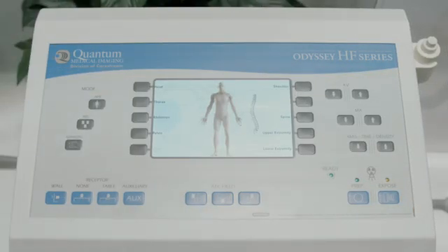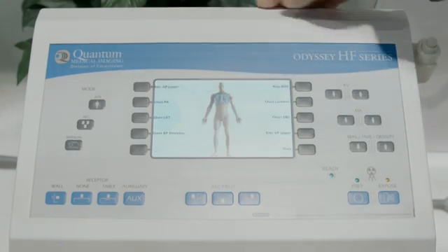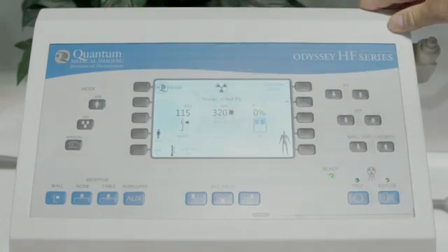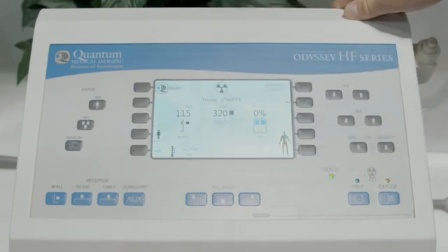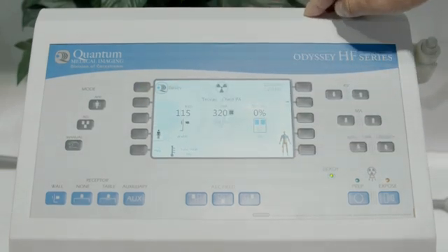In this example with the Odyssey generator, we're going to set up for that same two-view chest. From the APR, we select thorax, we select the chest PA, and the generator is ready to acquire. We can still toggle between patient size for variations of generator technique, and here we are ready for that PA.